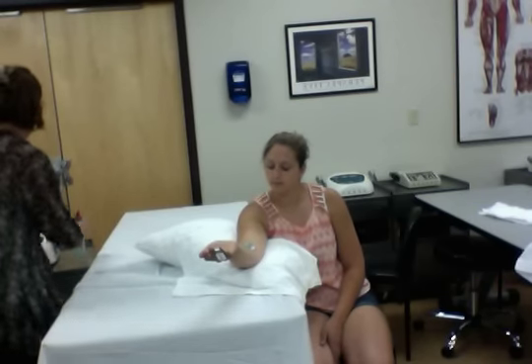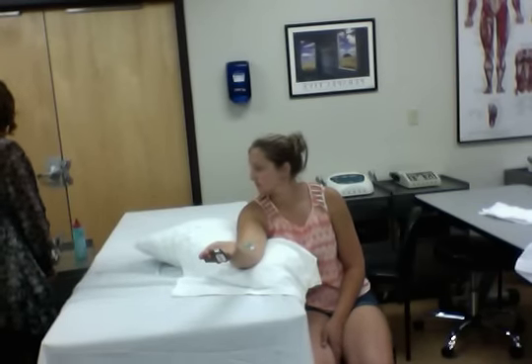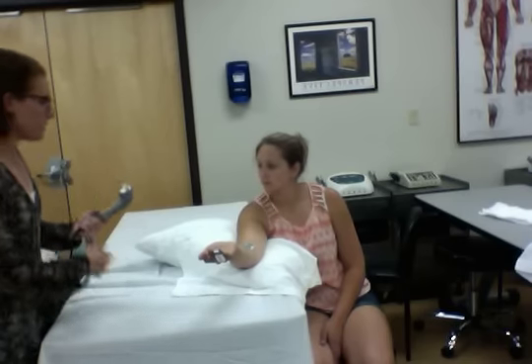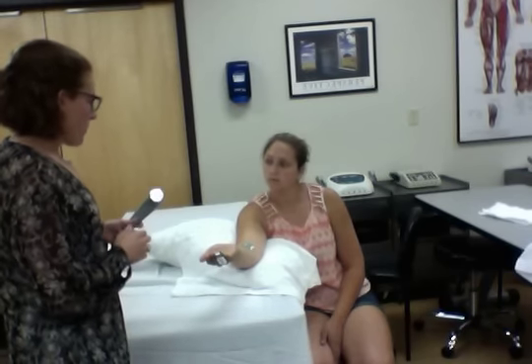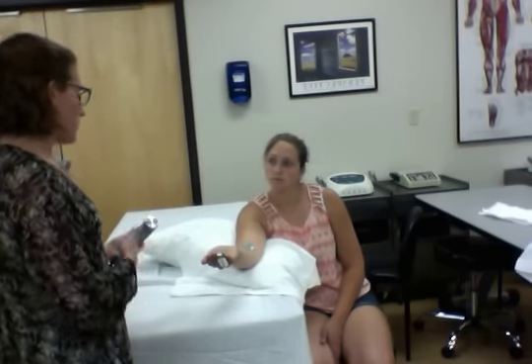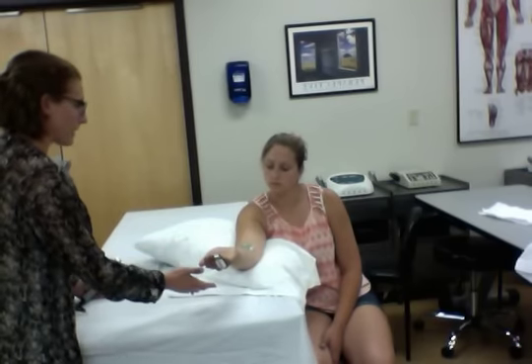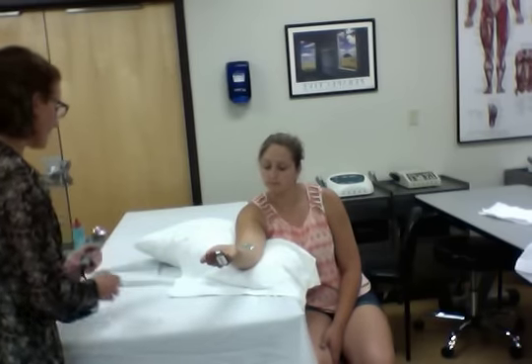All right. I'm going to turn my time up here to 12. And what this is going to feel like is probably about like that gel feels for most of the time. Once we get a couple minutes into it, you should feel some warmth. I'll ask you about 2 minutes in if you're feeling some warmth, and if you're not, we'll go ahead and turn the intensity up a little bit. And if you are, then we'll just keep going. And we're just going to let your arm relax like that. Does that feel okay to you? Okay, excellent.